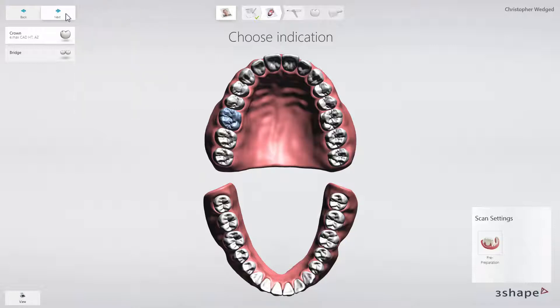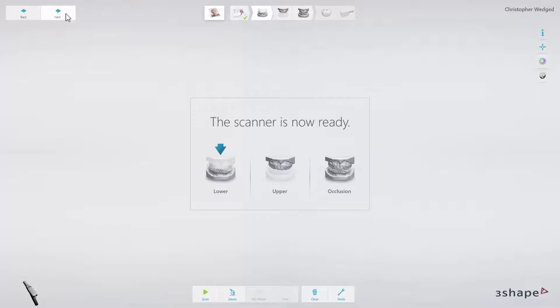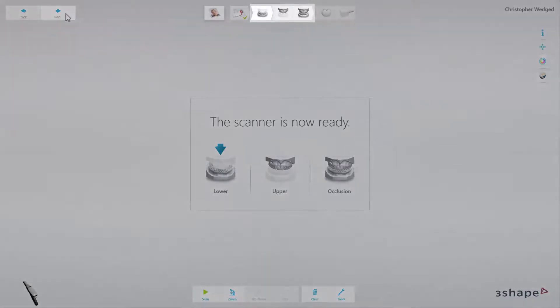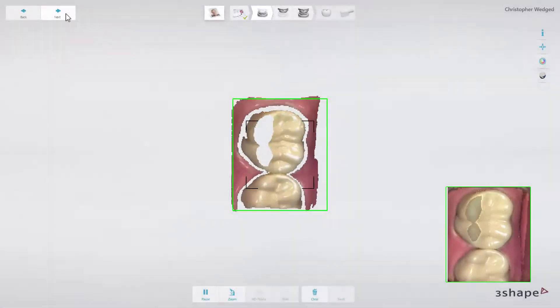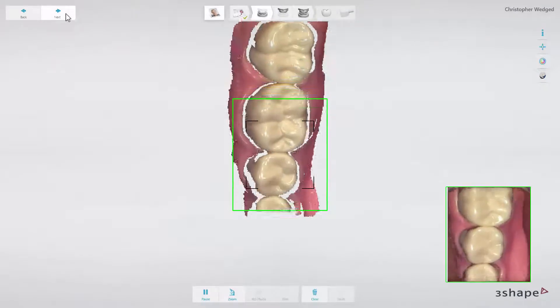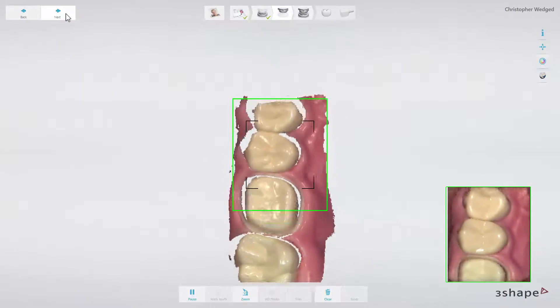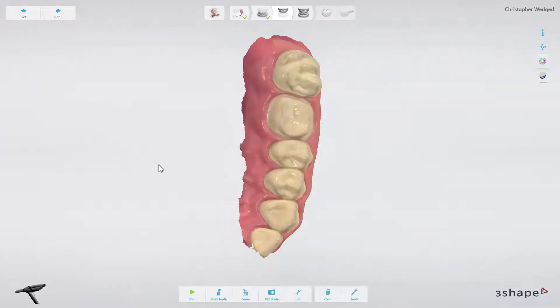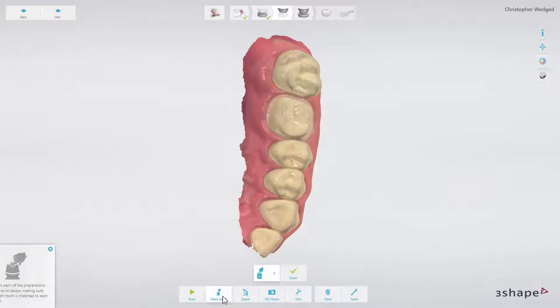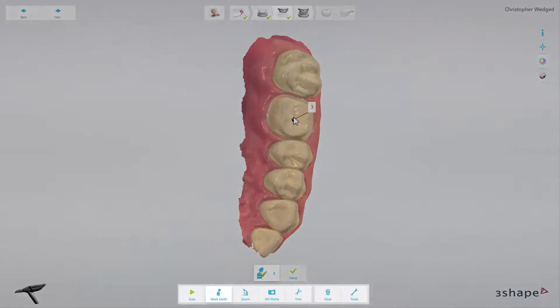Click Next and the scanning module will start. When the TRIOS module is open, the scanning icon is divided into scanning workflow steps that may be necessary for a given restoration. You can scan in any order. Always remember to mark the tooth on which the restoration is planned. Working with the TRIOS scanning module, you can use all the tools available for the TRIOS application.